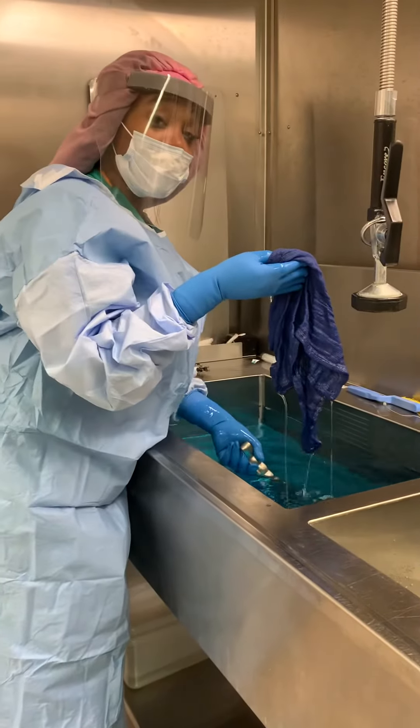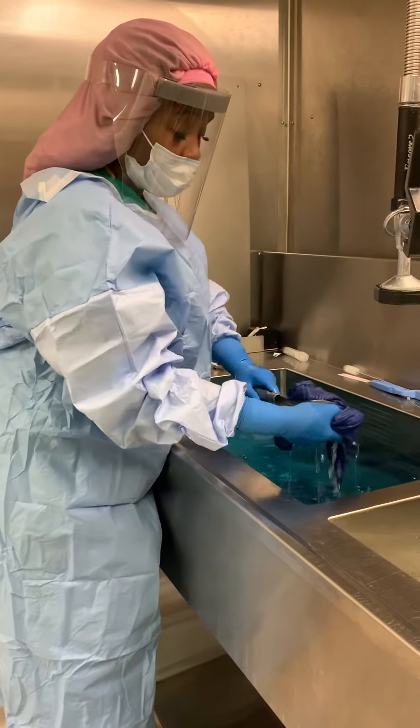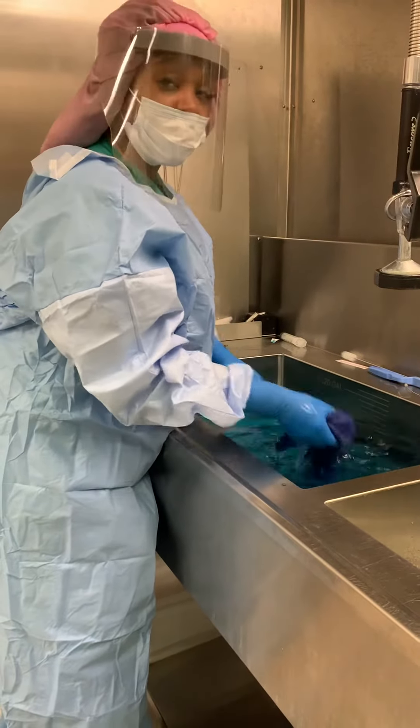You want to take your sterile cloth and we're just going to wash it — like a teeny little washing machine.